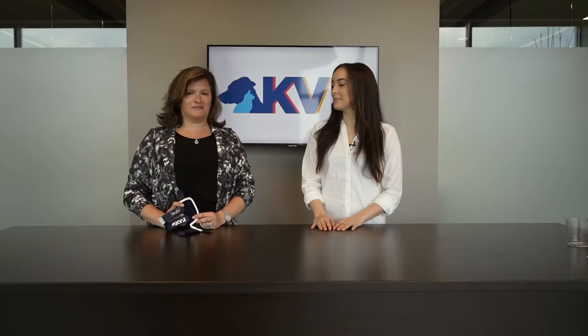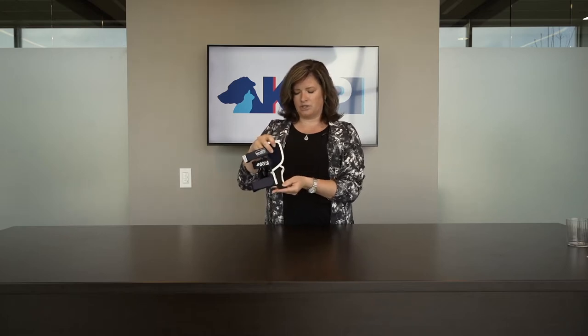When used properly, the Balto splint gives amazing support for front limb laxities, especially associated with the carpal joint. It's a unique brace that has a curved aluminum support down the backside — you can see it in this pocket here. This brace gives specific support to the front end and sits right up underneath the paw pad, so that you have that posterior support on the leg.